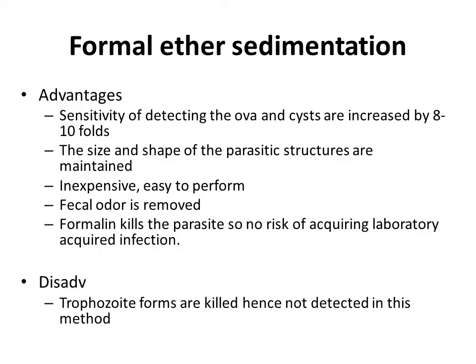Then we will move to the concentration techniques, which we already discussed. The formal ether sedimentation.